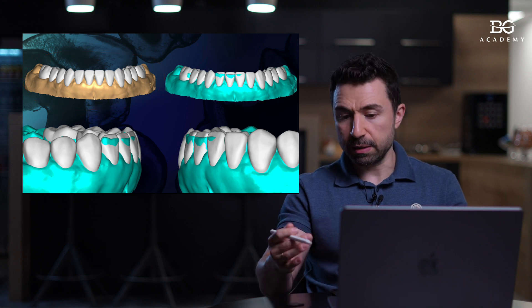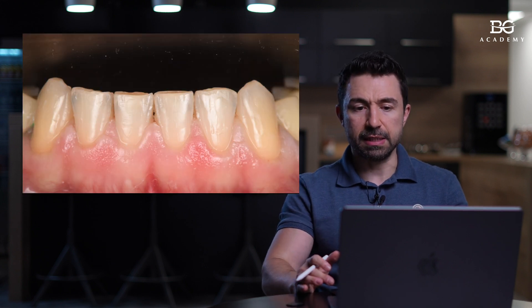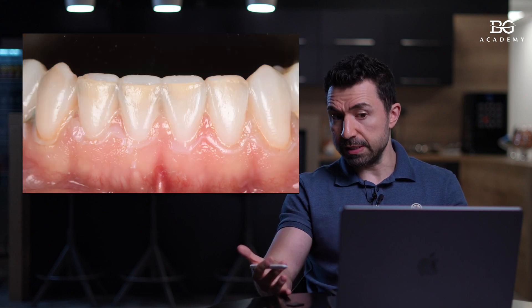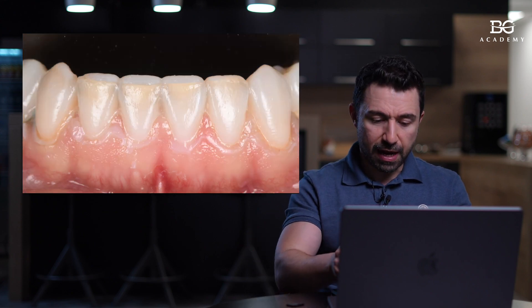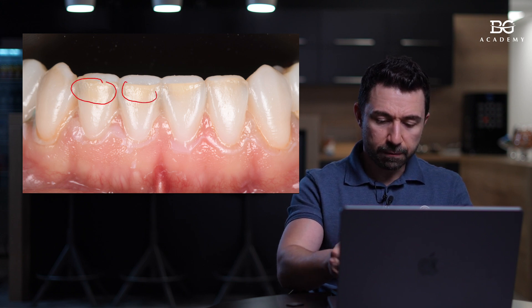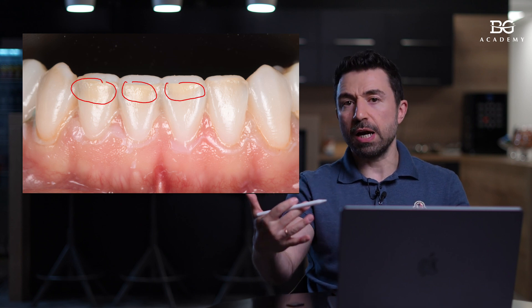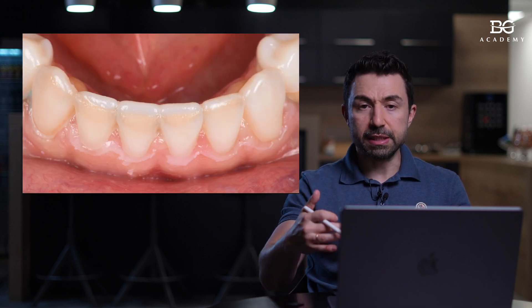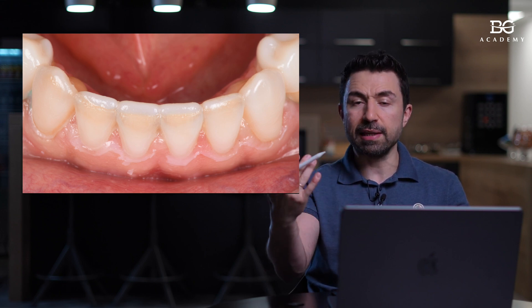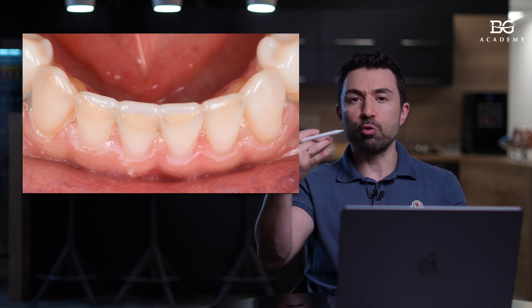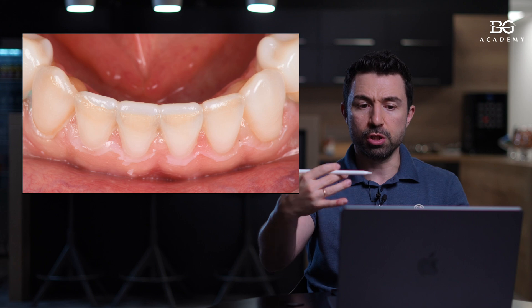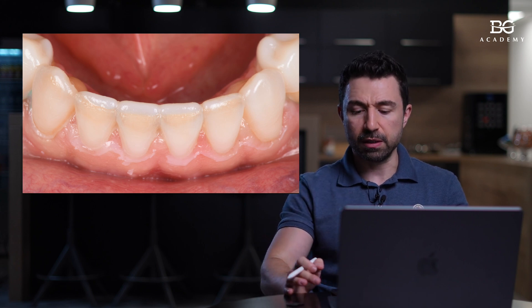Let me show you how it looks to make it clearer. Here is the initial situation before the mock-up, and here is the mock-up itself. You can see that we have exposed patient's teeth showing through the mock-up. What we are going to do is pre-cut these extended parts of the patient's teeth to the level of the mock-up — that will be our zero position — and then we take a depth cutter and start to give space for the dental technician to have good results with the final restorations.